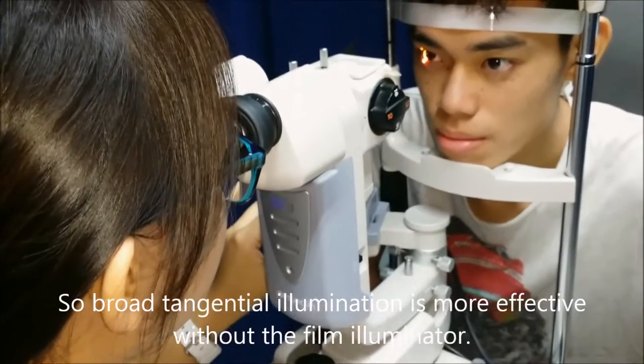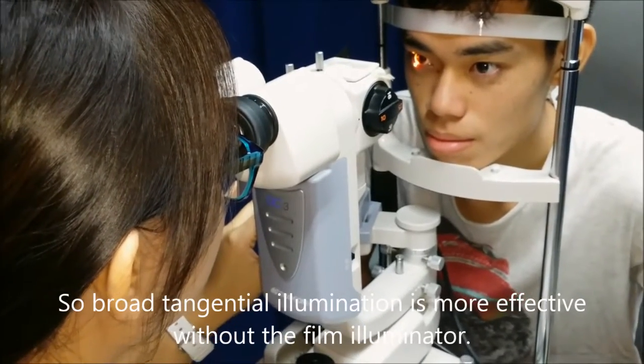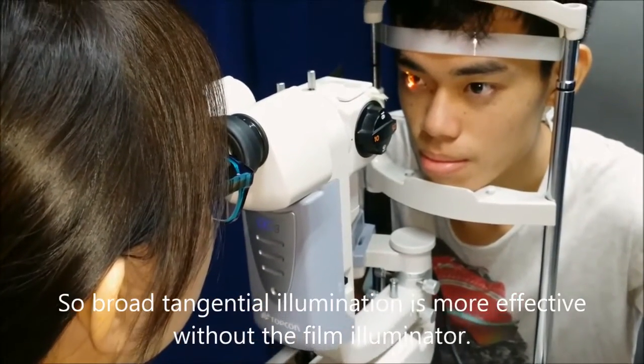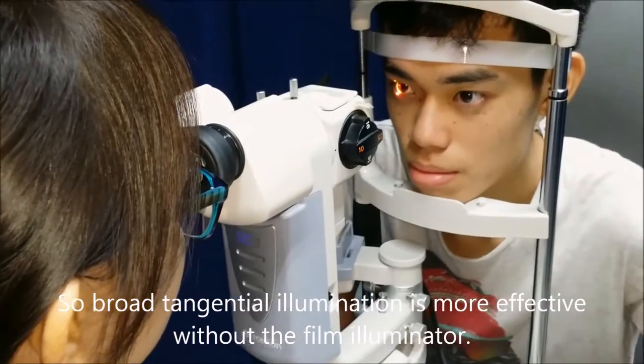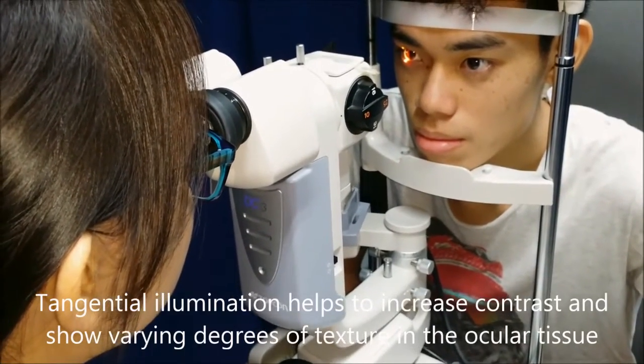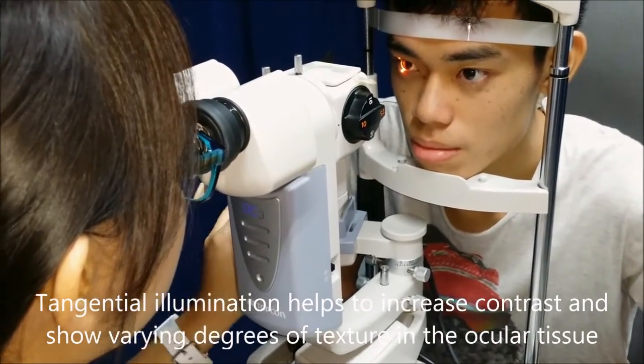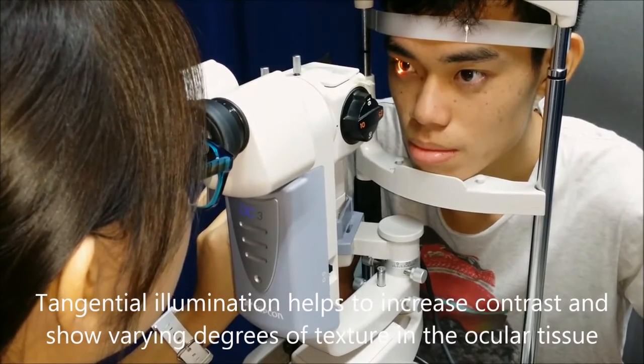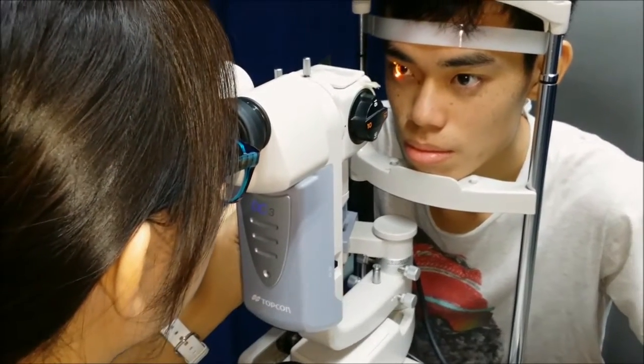Broad tangential illumination is more effective without the film illuminator. Tangential illumination helps increase contrast and show varying degrees of texture in the ocular tissue.